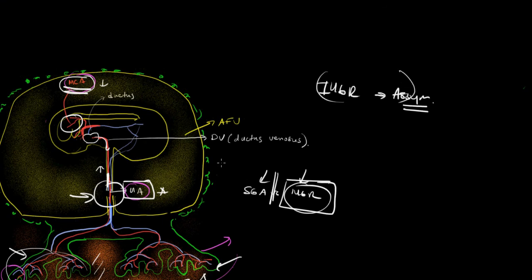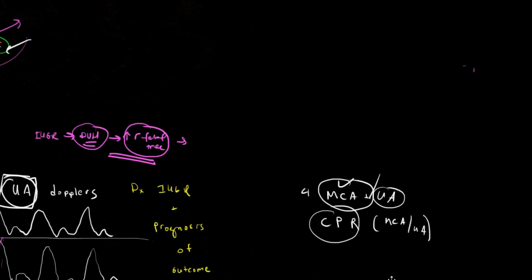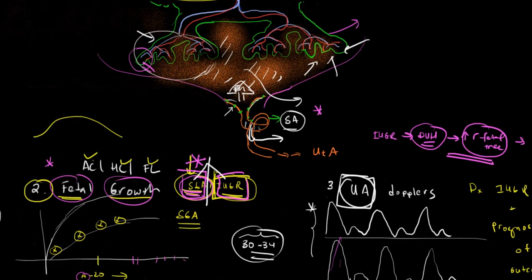Once again, these are related to chronic maternal underperfusion. These are chronic features. They're not related to an acute adverse event. In general, I'll tell you a general principle. So far, everything we spoke about are chronic features, and chronic features are usually good for antepartum monitoring. When you start to look for acute features, that's when you get into intrapartum monitoring, because labor and delivery is a risk for asphyxia. But I'll clarify that more.